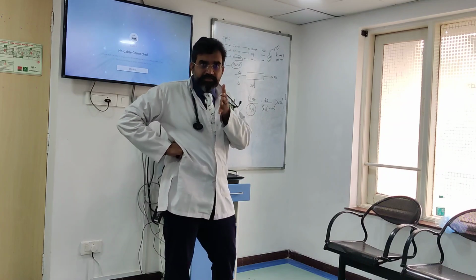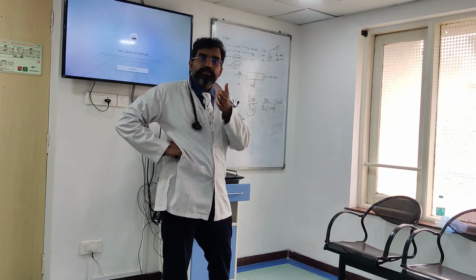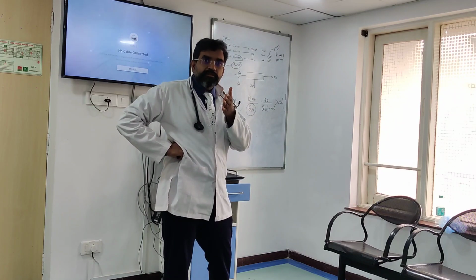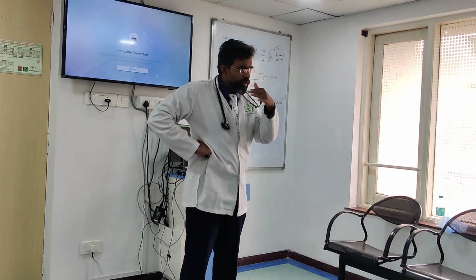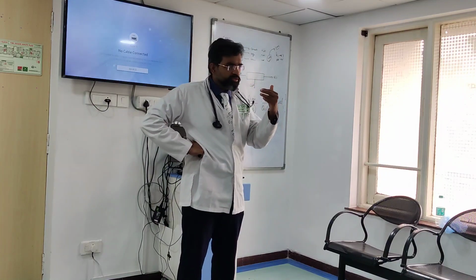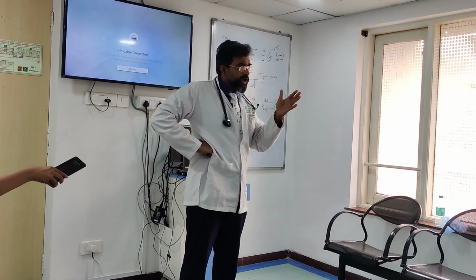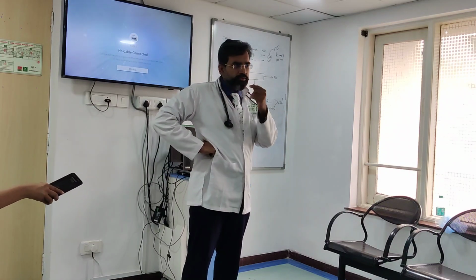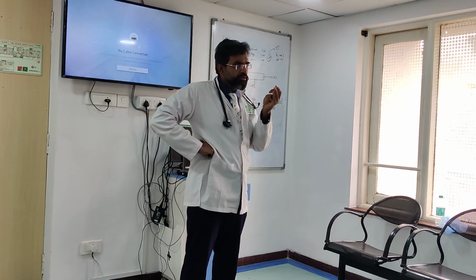CVVHDF. Yes, I want to increase my efficiency. So what will I use? Both, CVVHDF. I will want to use both. First, is this clear to all of us? That I want to use both? I want to use both, that's clear? बाद में बात करूँगा. बाद में करूँगा. Clear on this? I want to use both.